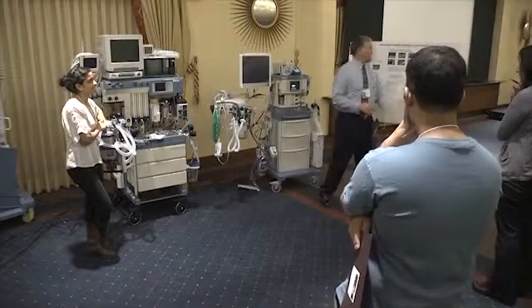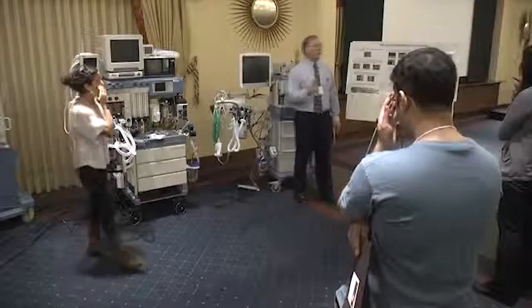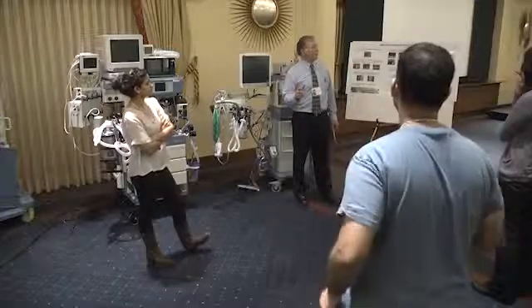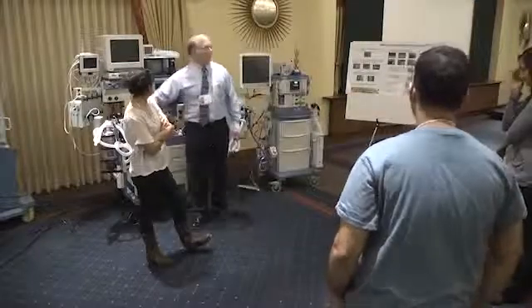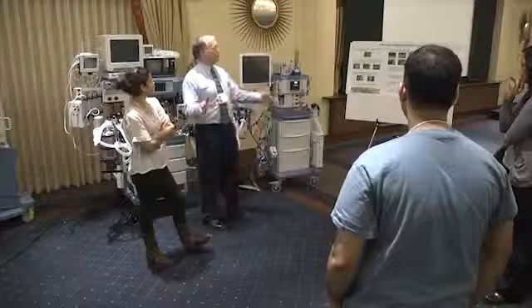Here we want you to turn on your machine, make sure that your ventilator runs, check your low oxygen alarm. If you check any alarms at all, check that, okay? And then finally, with your machine, make sure that your vaporizers are off, that your APL valve is open, that your machine is at 0, and just have a final resting place.